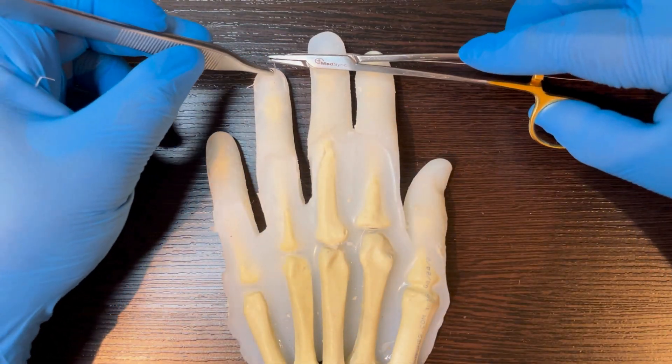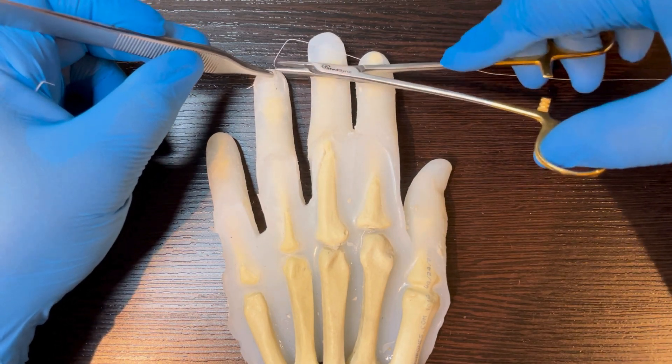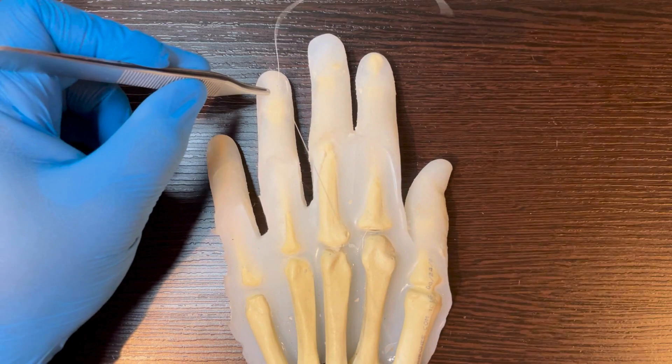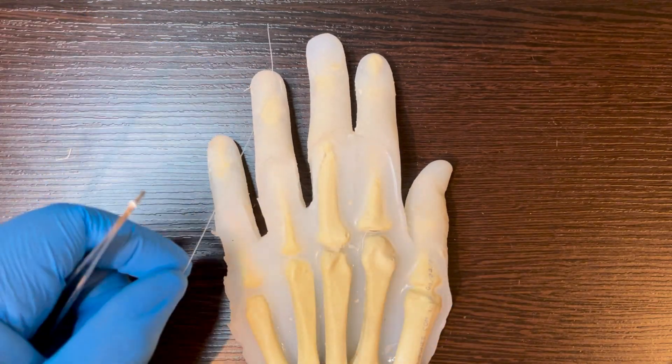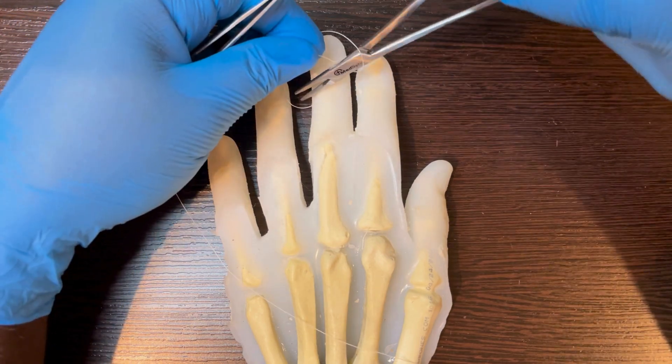Now you suture the sterile matrix. There are different options, but interrupted with a fast-dissolving suture is the simplest technique. Suture from the cut tip into the more stable finger.